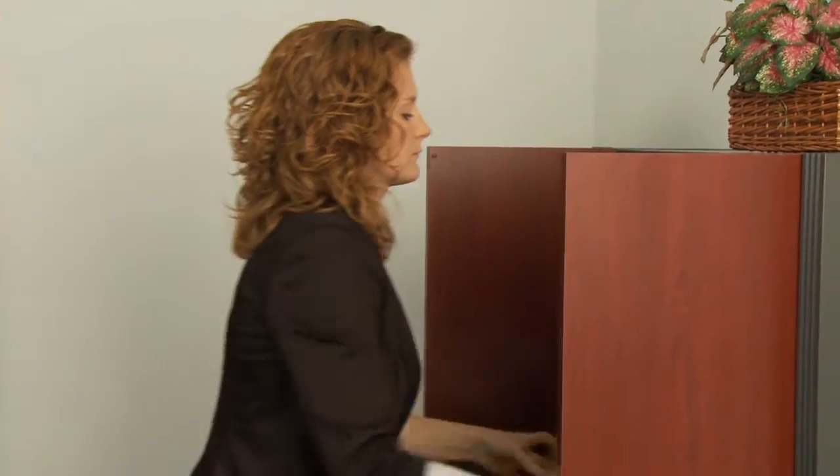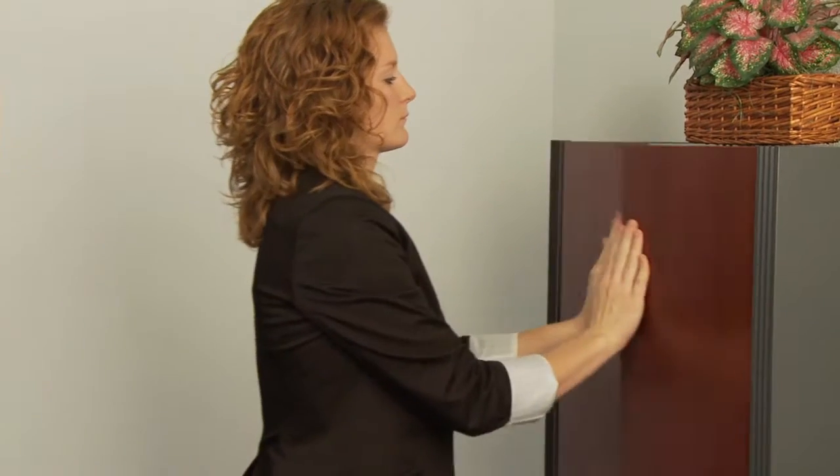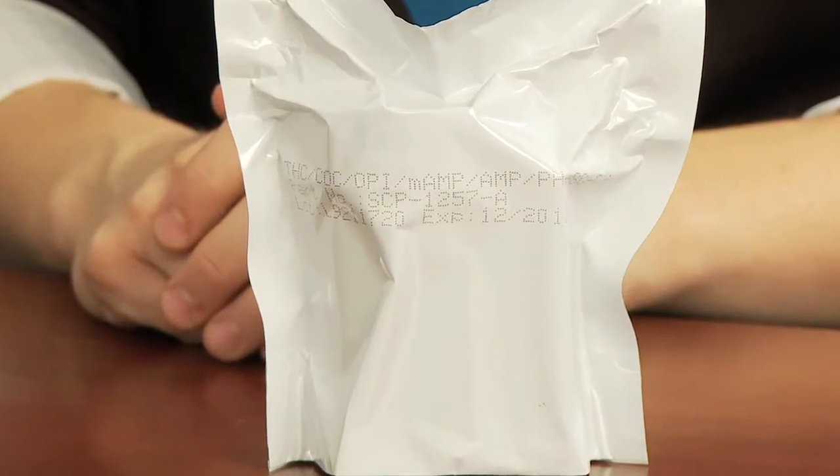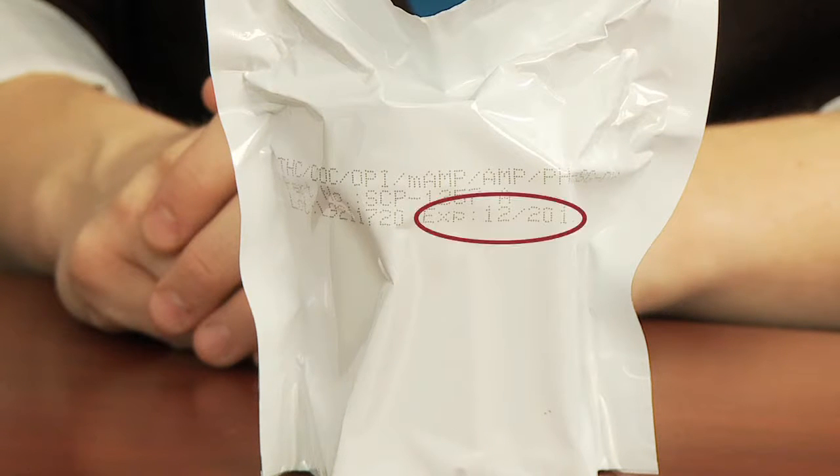To properly store StatCup tests, keep them at room temperature. Do not expose tests to hot or freezing temperatures for a prolonged period of time. Adhere strictly to the expiration date on the foil pouch, and do not use tests beyond that date. Do not open the sealed foil pouch unless testing will immediately follow.